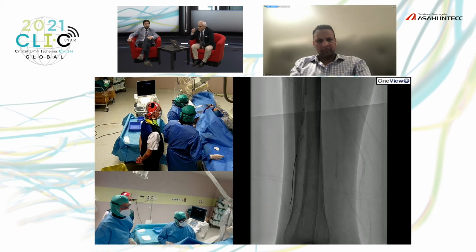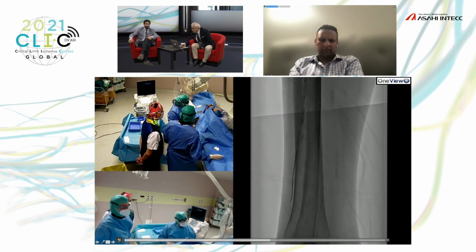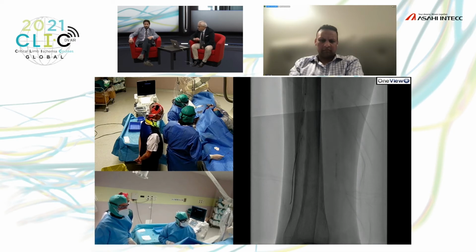Probably you create the ideal way to advance the wire. This is my feeling with this wire. So I had to modify the technique. You look, because the advancement is very, very slow.